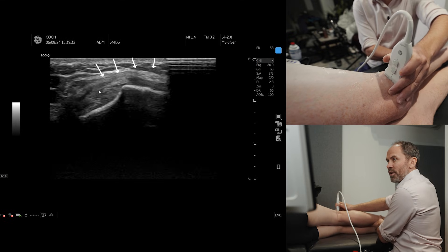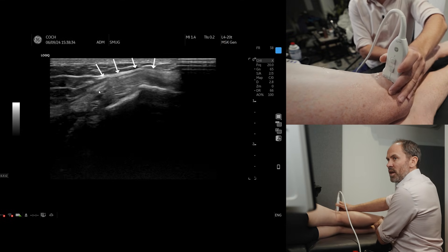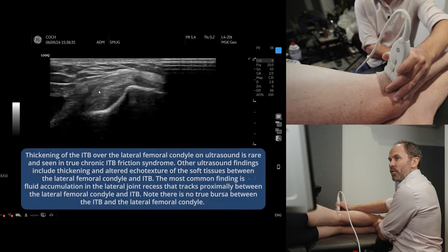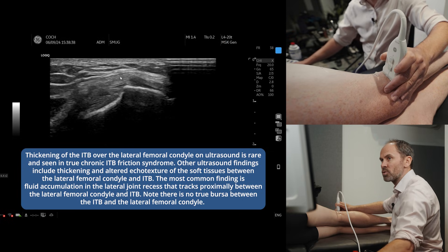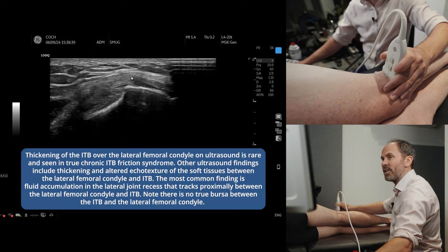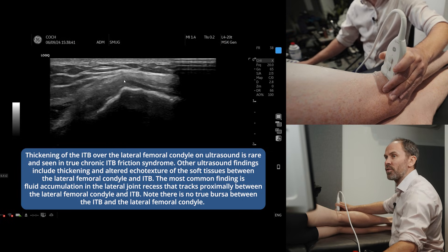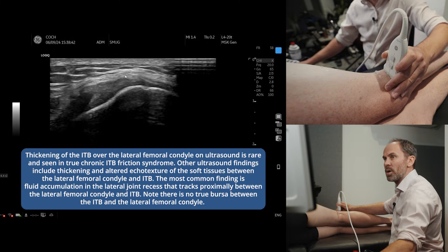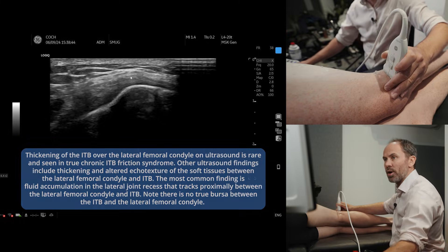So from anterior to posterior — what you're looking for is any fluid tracking out of the lateral joint, and any irritation or thickening of the tissue between the ITB and the condyle.